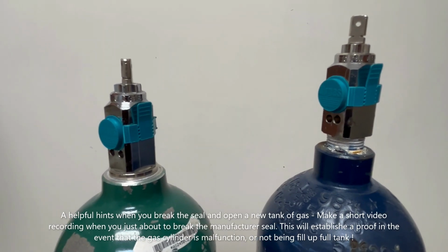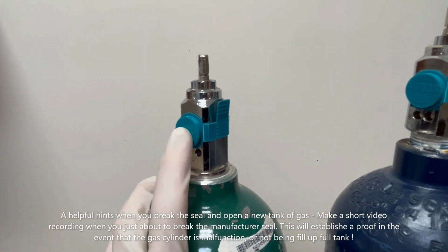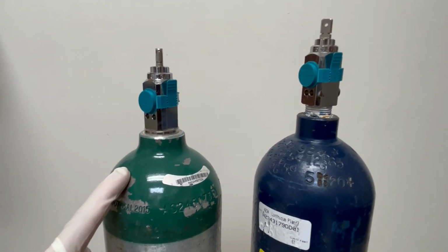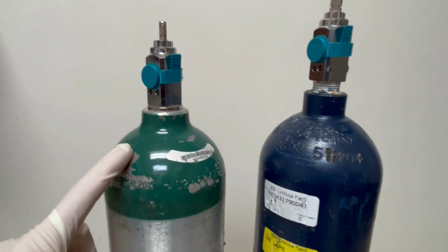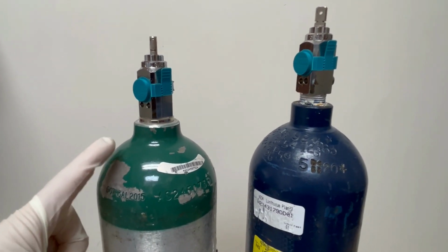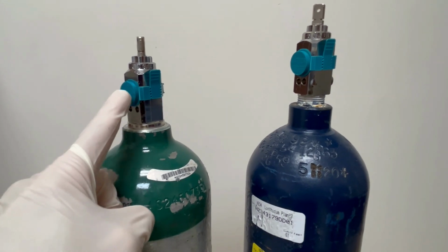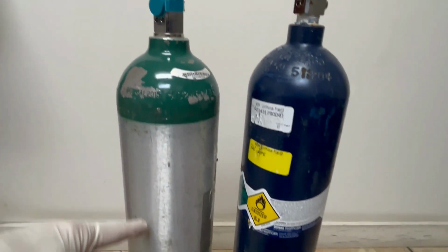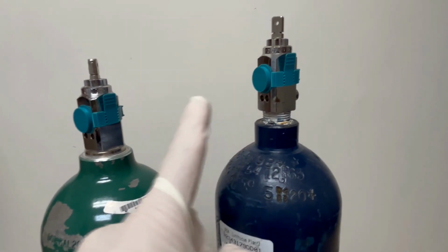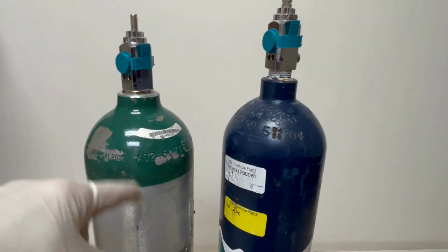We had an incident in our office when we put the cylinder in, that is oxygen, and we did not record it obviously, and then we used this oxygen tank for only about 5 minutes, and then the whole gas gauge pressure went to 0. So we reported it to the air gas company, and they did not reimburse us. So we learned a lesson. From now on, when we mount this into the mobile unit, we make a short videotape of the whole process. That way you can have proof that if the tank is by any chance empty, they did not fill it properly, we can show it to the air gas supply company that there could be some malfunctions, or the tank may not be fully filled properly.